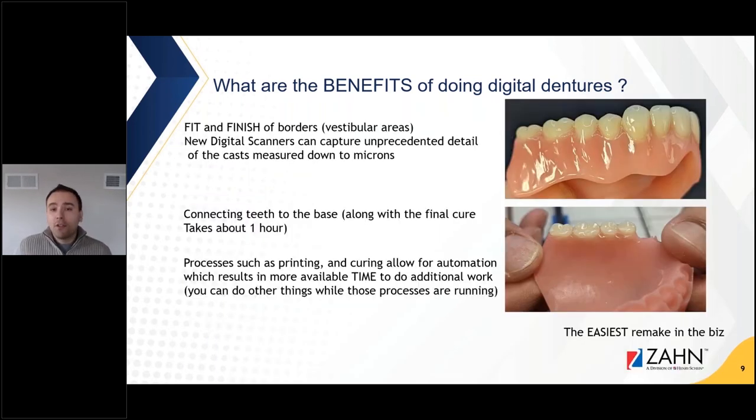Another thing is fit and finish of the borders. When I talk to my peers, when I do research, I always read about the same thing. It's sort of a unifying theme that goes throughout digital dentures, that their fit is really great and the borders are really great. The reason for that is because we have dental desktop scanners, they're able to capture a really high amount of detail that you couldn't capture from an impression before.